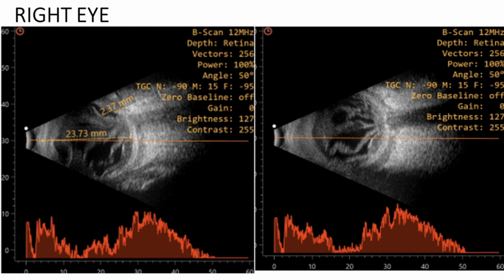There is a membranous echo in the vitreous cavity showing high spike, most probably a retinal detachment with attachment at the optic nerve head. Thickening of the choroid is also noted. There is some fluid collection in the subtenon space.